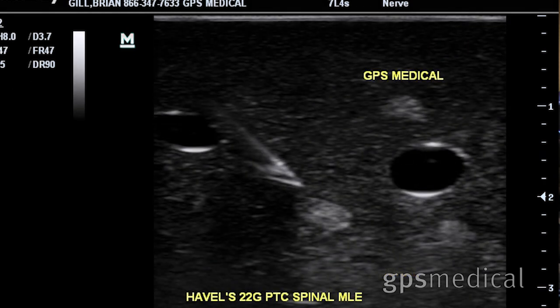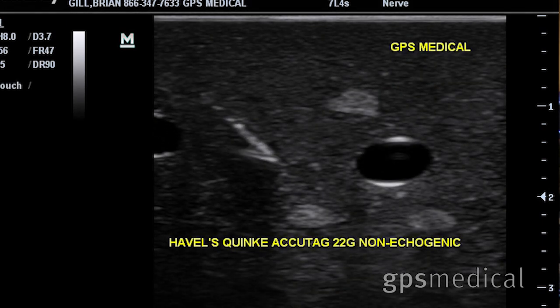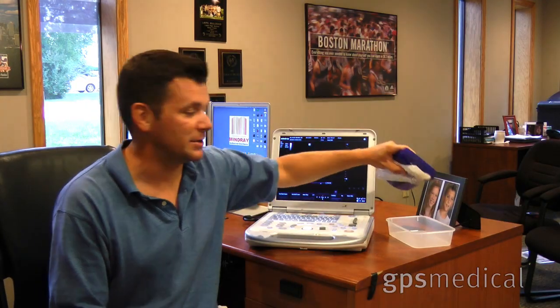The company Havels has done a really nice job. They sent me a bunch of different types of needles — some have etching on them, so they're echogenic, and they really light up and you can see that on the screen.